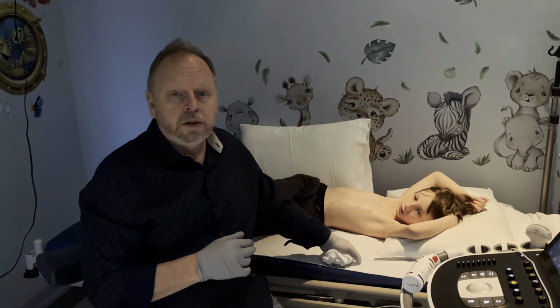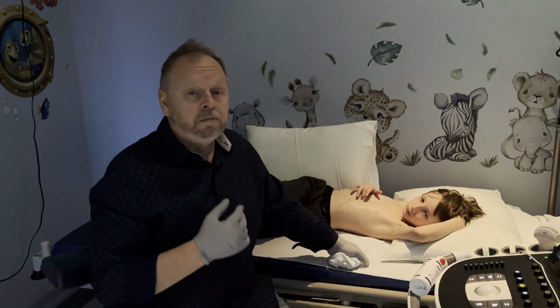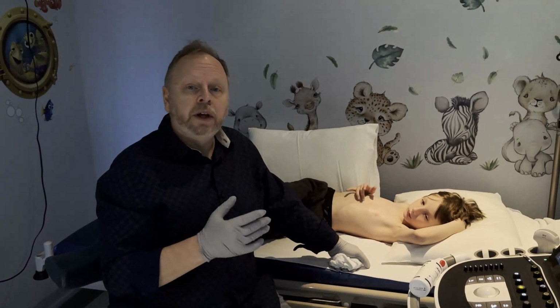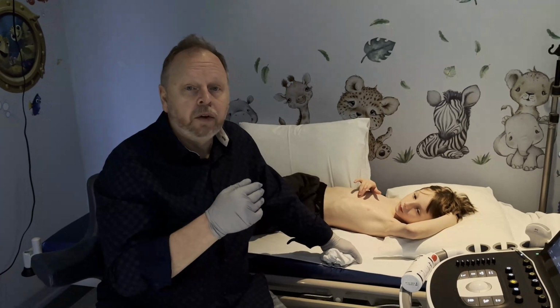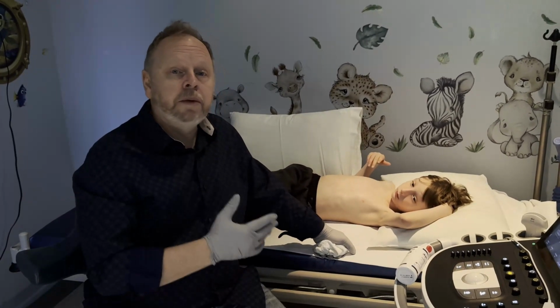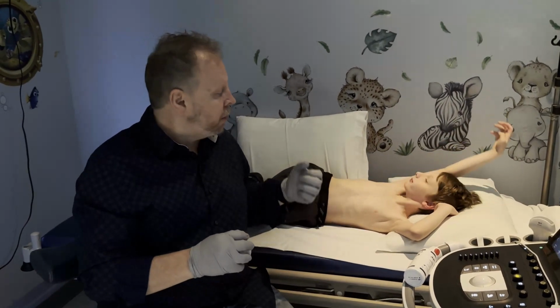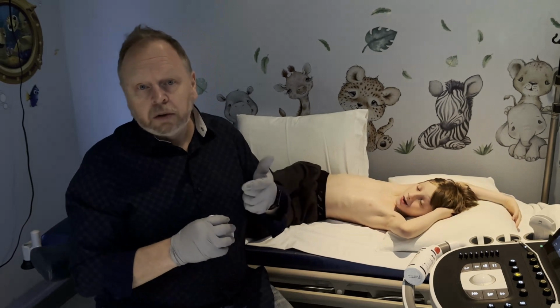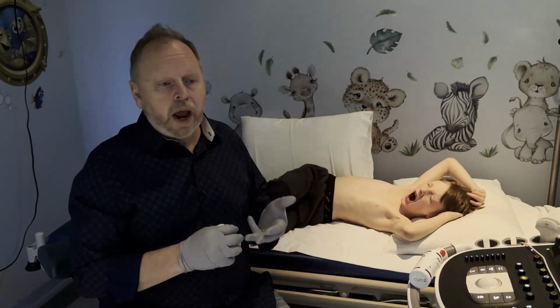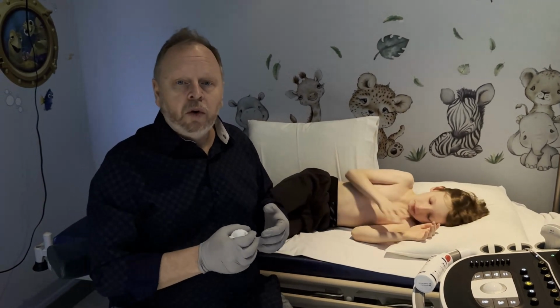Practice subcostals. Those can be a little bit challenging, especially with bigger kids. And always practice in the apicals. It works great, especially in a lot of the adult patients, if you can get in there. So don't think that you're limited to just the parasternal short axis. As we saw, we can see them parasternal long, parasternal short, apicals, and subcostals. So every view that you get, you can try to track down some coronaries.